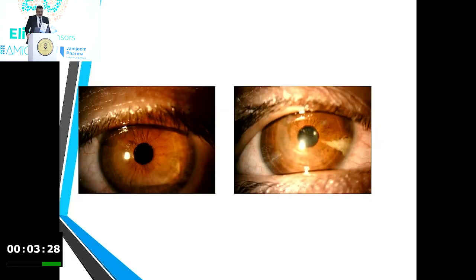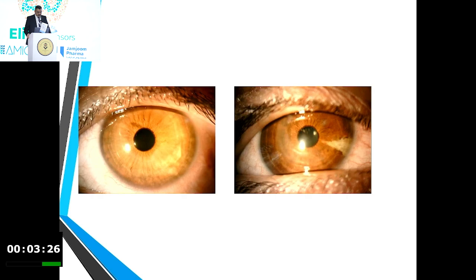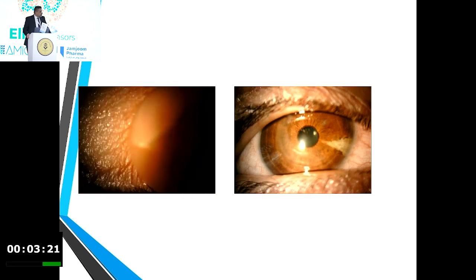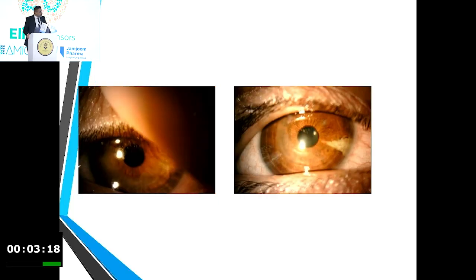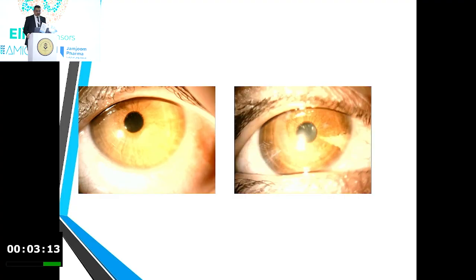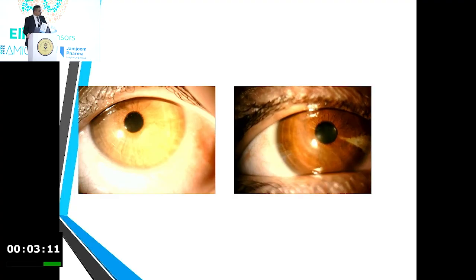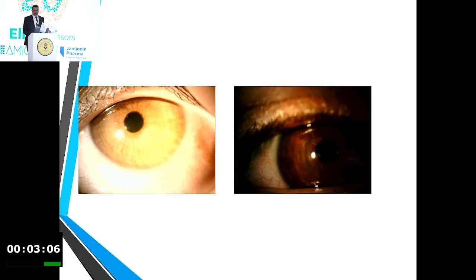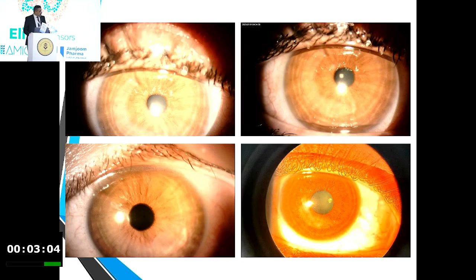So this is the result. These are the patients postoperative after 2 or 3 weeks. We have a good shape of the cornea, good shape of the eye. I just put these videos to show you the result after the operation. It is a very good shape of the eye, acceptable, no sutures, clear cornea. And these are other patients. Usually, as I said, I put one segment at the steep area of the cone.